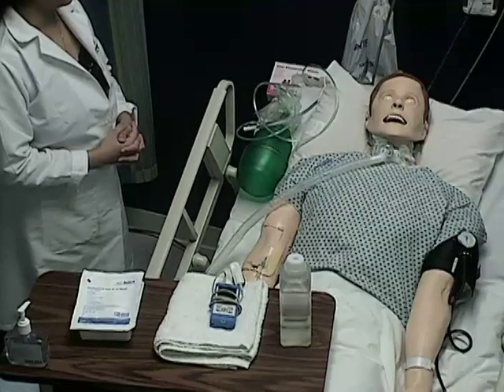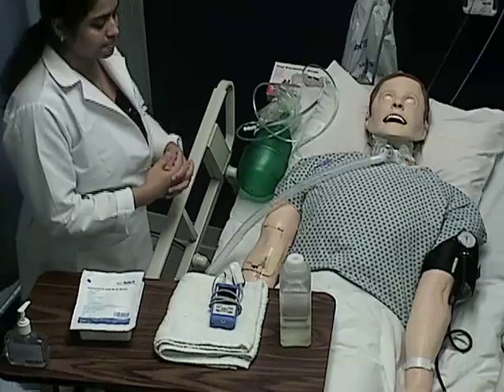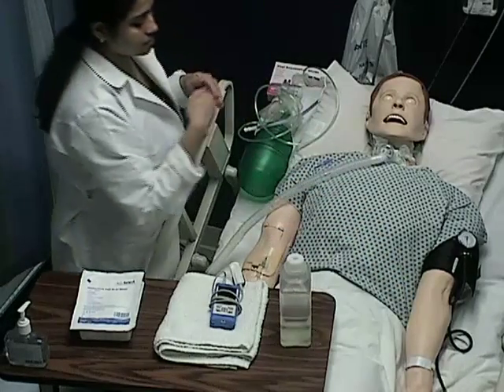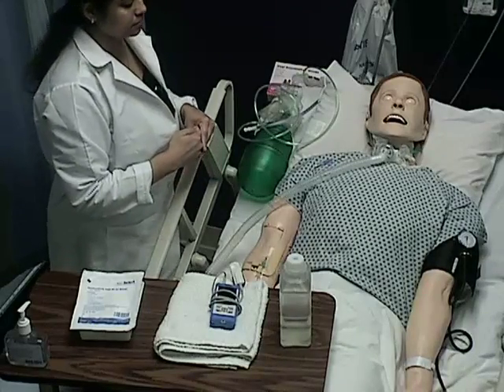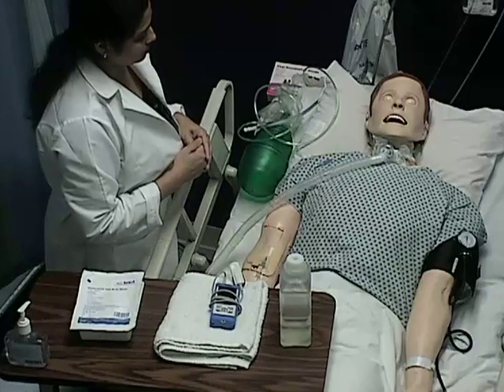Performing Trach Care. Step 1. Assessment. Identify patient using two identifiers. Perform pulmonary assessment. Auscultate lung sounds. Assess patency of airway and condition of surrounding tissue.